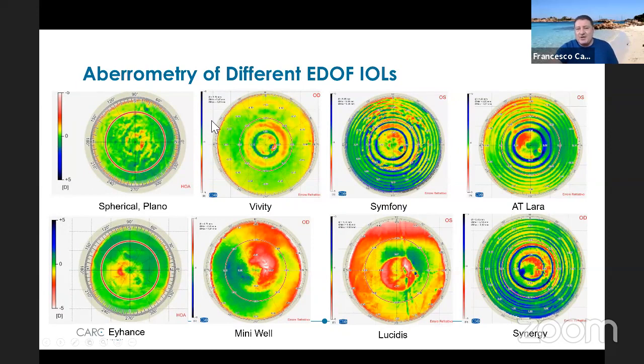But at the same time, if you want to compare, for instance, how a refractive shaped EDOF IOL transmits the light compared to traditional diffractive patterns, you can really appreciate, not only from what you are told by the patients but from a diagnostic point of view, that this lens is definitely closer to a monofocal than to a diffractive in terms of halos and night vision problems.